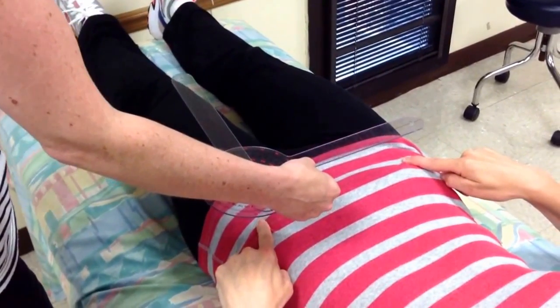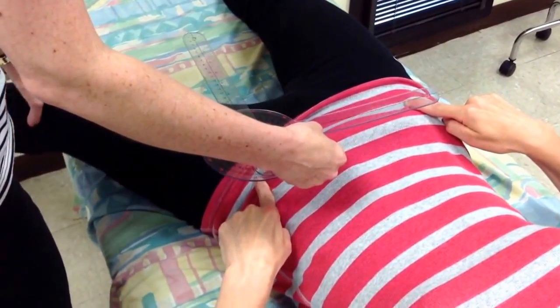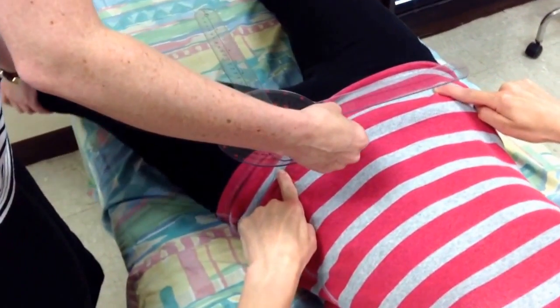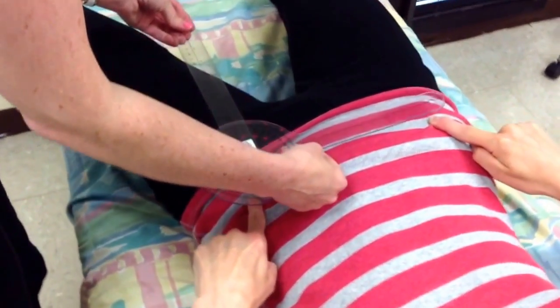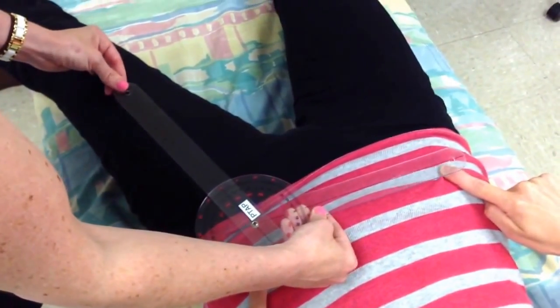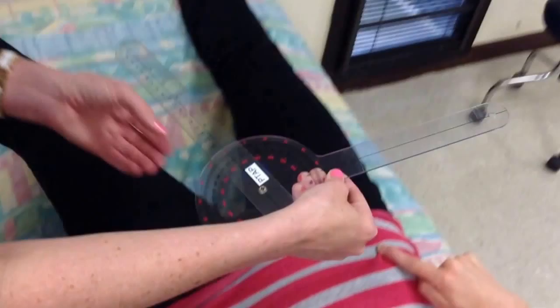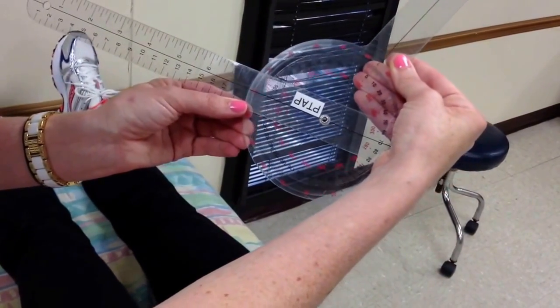I want you to bring this left leg out to the side as far as you can. Suzanne started to externally rotate, so I just brought her back in to where she was purely doing abduction and no external rotation. You need to palpate to make sure you're lined up with the patella. So Suzanne has 20 degrees of hip abduction.